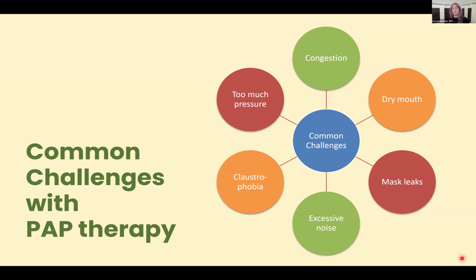I don't know that excessive noise is much of an issue anymore. These machines used to be really, really loud. I feel like they're super quiet now. As someone who loves a little white noise, I don't know that that's a big issue anymore. But if you are disturbed by a little bit of extra noise, that cycling of the machine sometimes can be disruptive. Patients who have claustrophobia can often feel like if they're wearing PAP, that they'll panic.